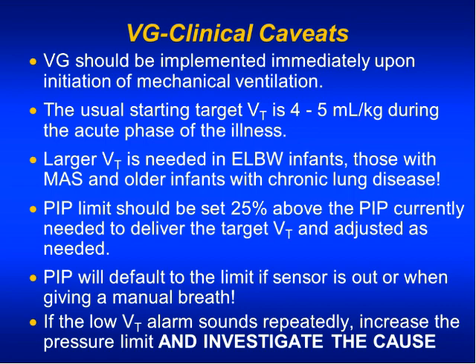Now, getting a little bit out of time, so I'm very quickly going to run through some of the practical applications, and hopefully we'll still have a few minutes for questions. So how should we do this? Well, because lung compliance changes most rapidly soon after birth, it's probably a good idea to start volume guarantee right off the bat. And depending on the kind of baby that you're ventilating, you pick the right tidal volume.